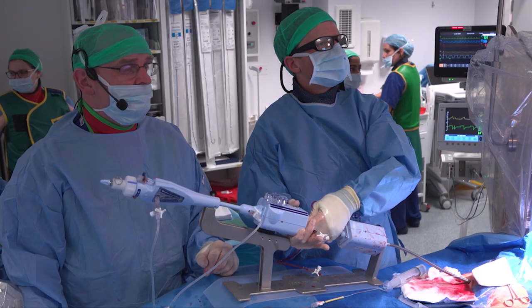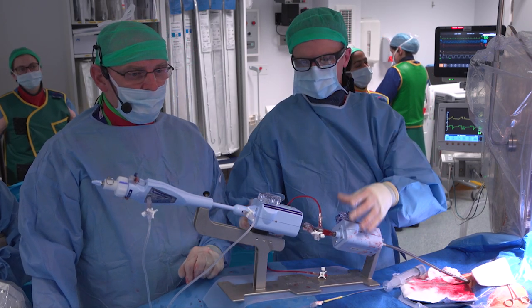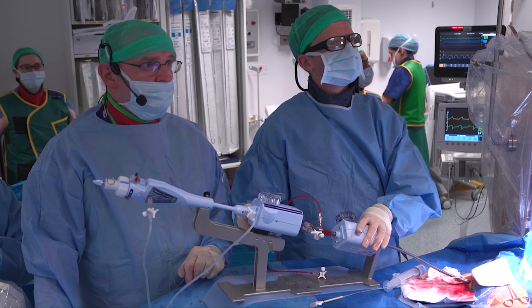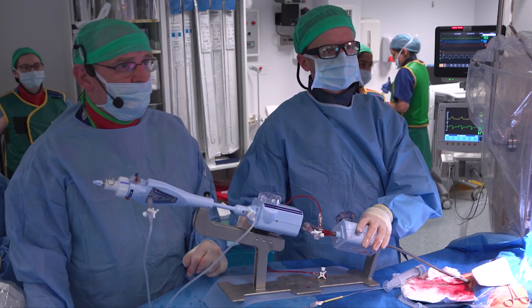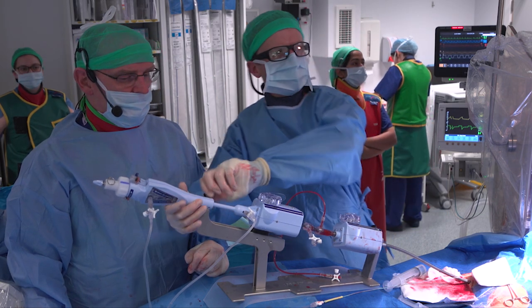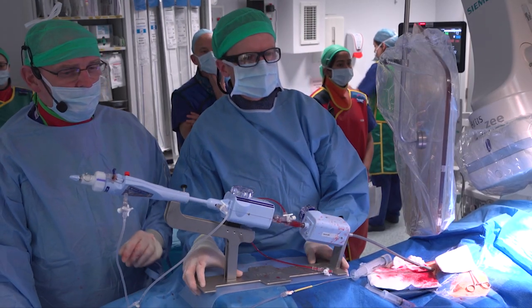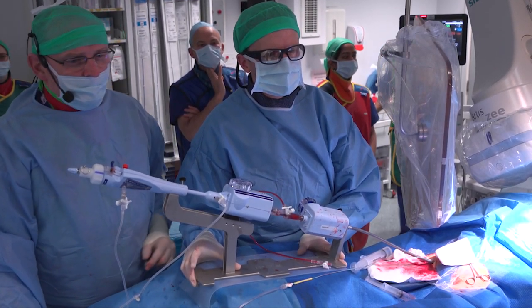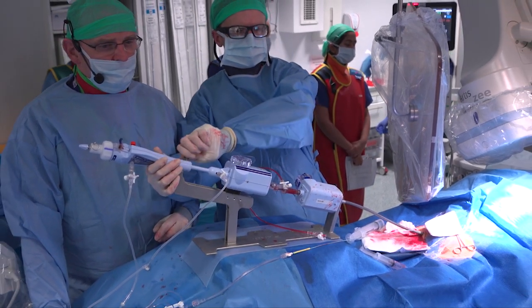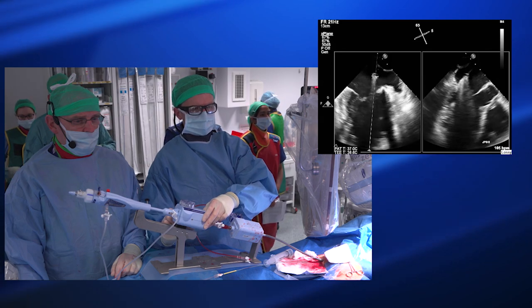The clip delivery system is now advanced into the left atrium. We know we're likely to get stuck on the Coumadin ridge, so I'll be aware of that as we start to turn the M knob to flex down towards the mitral valve. Usually it's flexion with the M knob and posterior torque. We're now positioning using the bicommissural view and the LVOT view, positioning above the mitral valve.